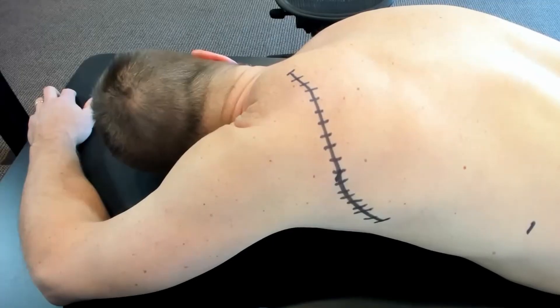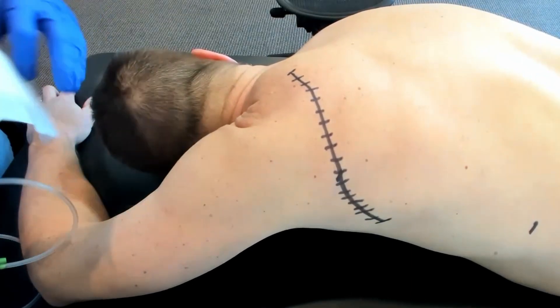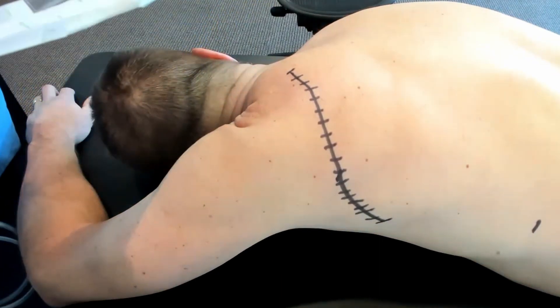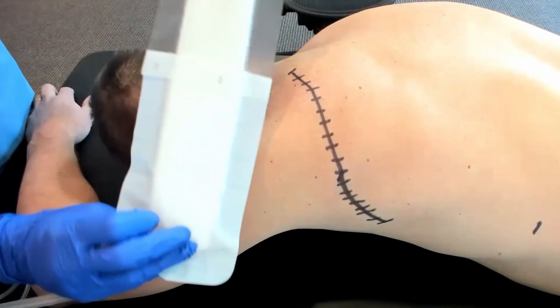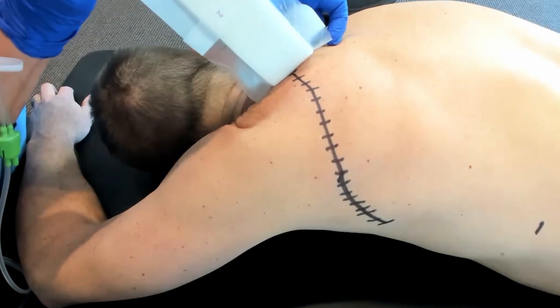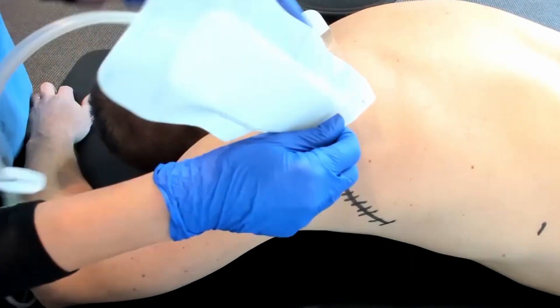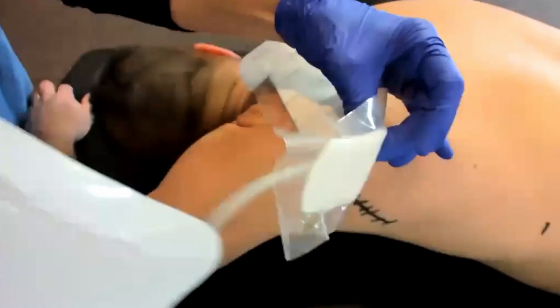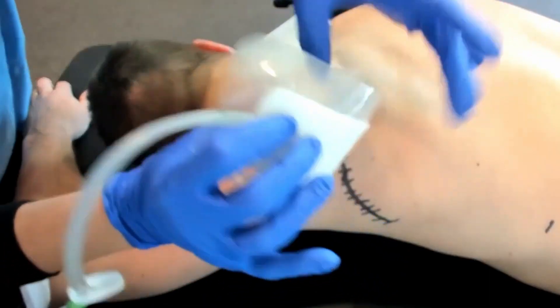When placing the dressing, it has backing layers one and two. You're going to take off number one first. If you have a lot of hands you can take it all off, but this stuff wants to stick to itself, so if you're working alone you might want to put one side down then two. You want the incision right in the middle of the dressing, so you really have to watch it all the way down. Try to stay away from any wrinkles — that's easier said than done, especially depending on where the incision ends up landing.